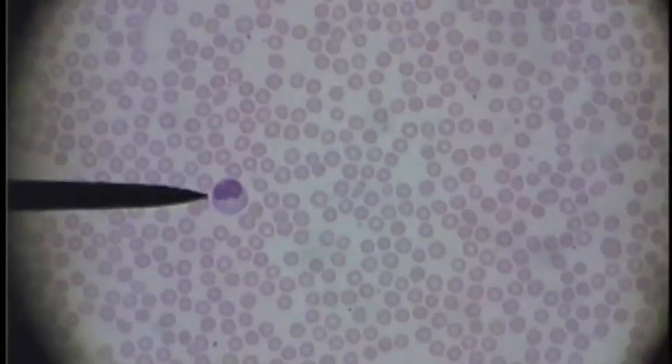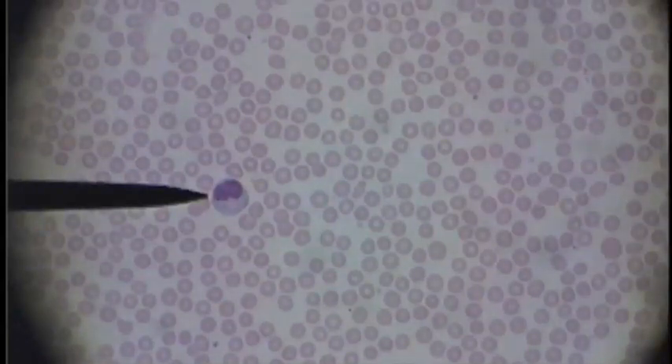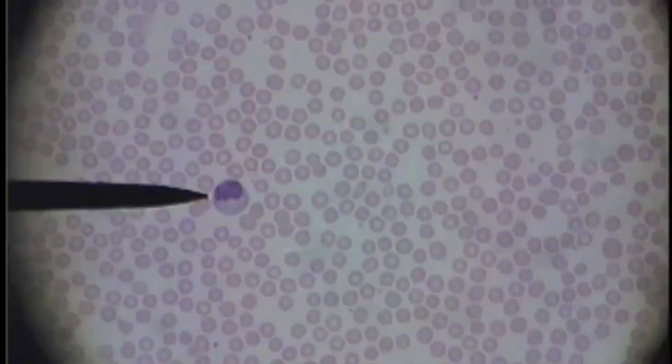This is a monocyte — much larger than the red blood cells around it. It has a nice large nucleus but lots of cytoplasm around the outside, and the nucleus looks kind of flattish on this one; sometimes it's kicked in on the side.